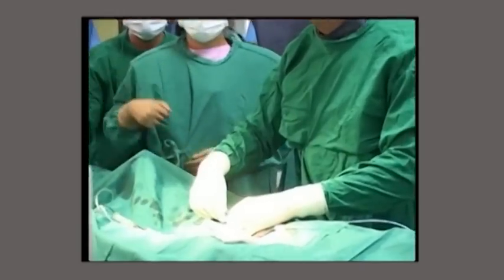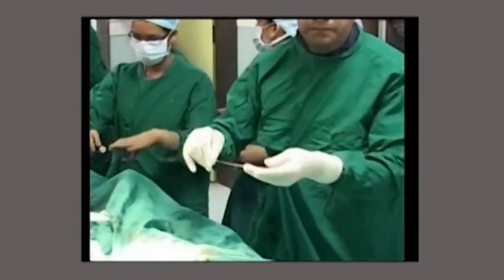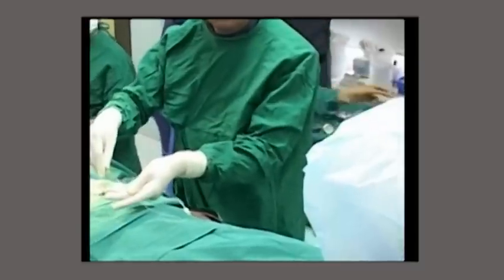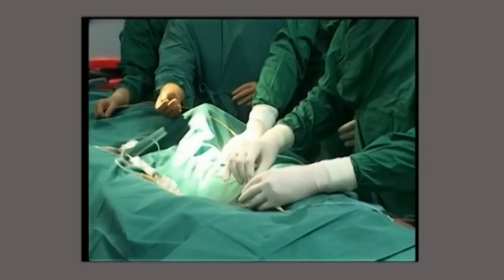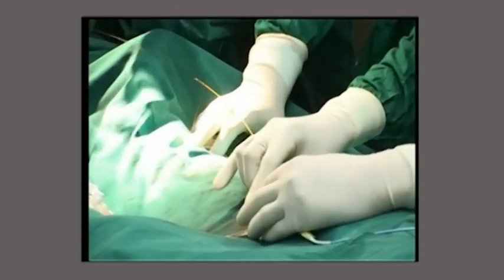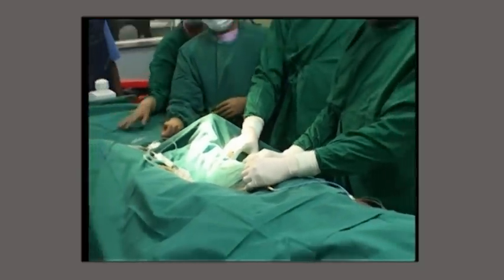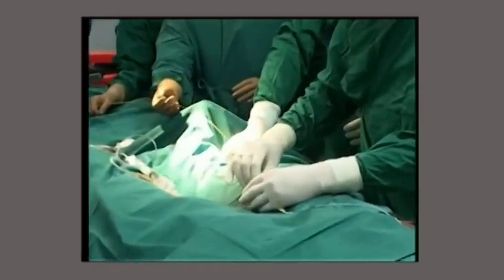I am now removing the IVUS catheter — this is a Golden Eagle IVUS catheter. That is the tip of the catheter, which has a lens by which we can look into the lumen of the coronary vessel, both on grayscale and virtual histology, to assess plaque burden and determine whether it is a fibrous, fibro-fatty, fatty, or calcified lesion.